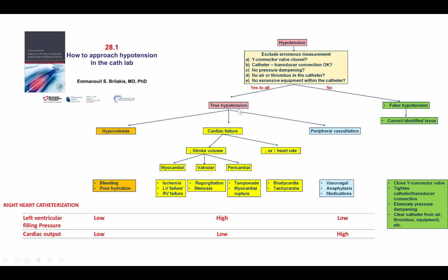Cardiogenic shock has to do with hypotension due to cardiac failure, although some patients may be in shock and have hypoperfusion while maintaining a systolic blood pressure in the low normal range. Using a Swan Ganz catheter can be extremely useful for determining the cause of the shock, but also for guiding subsequent management.